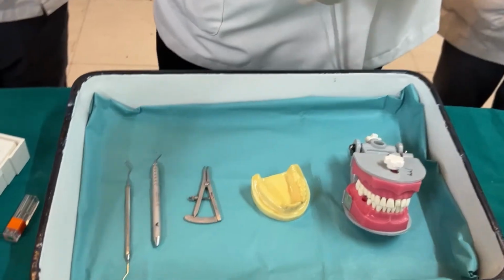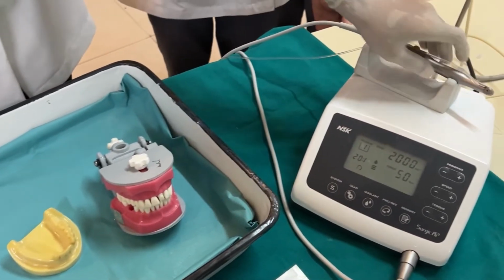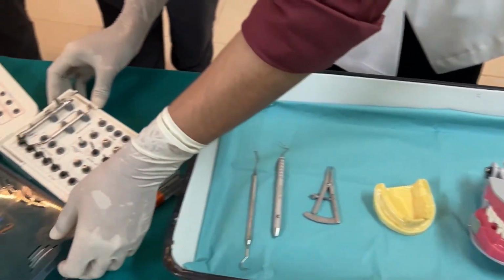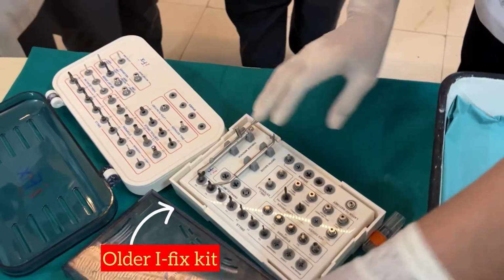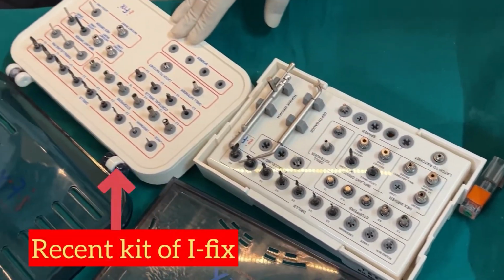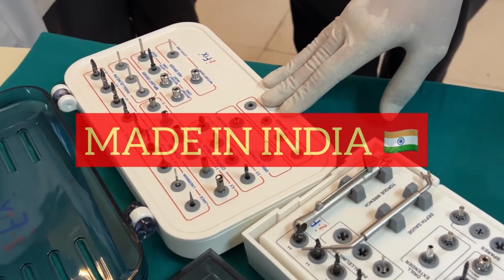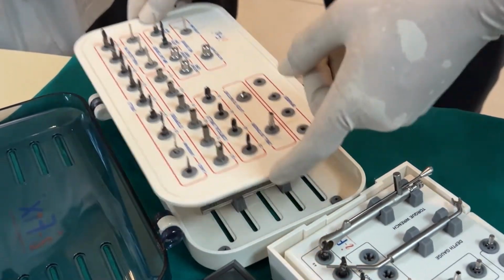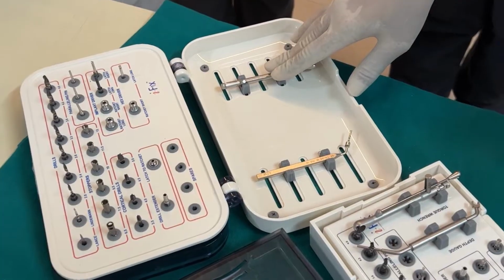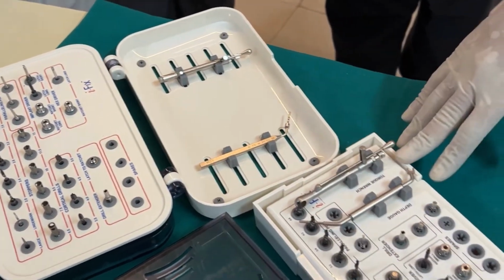For the demonstration of the placement, this is the Physiodispenser that we will be using, and these are the iFix implant kits that we will be demonstrating. This was the earlier kit. This is the more advanced, recent kit of iFix, a made in India implant system designed by IIT Delhi. This kit is of 2 chambers, in which the lower chamber has the depth gauge and the torque ratchet. Otherwise, other than the cortical drills, the remaining part is more or less the same.